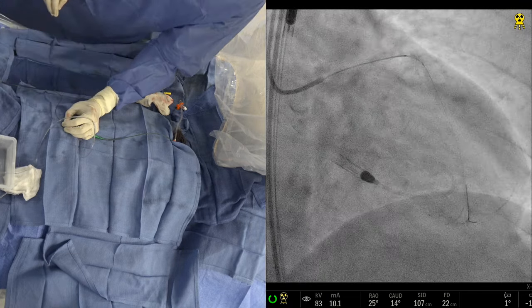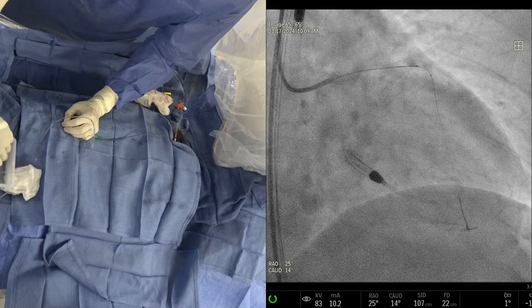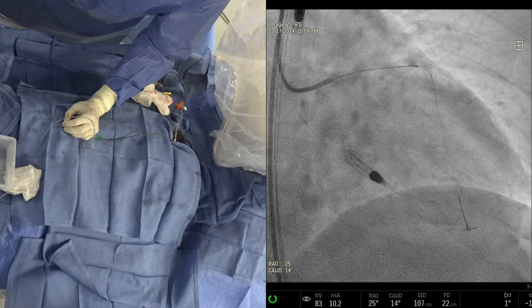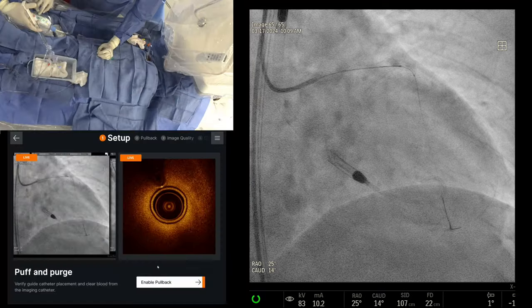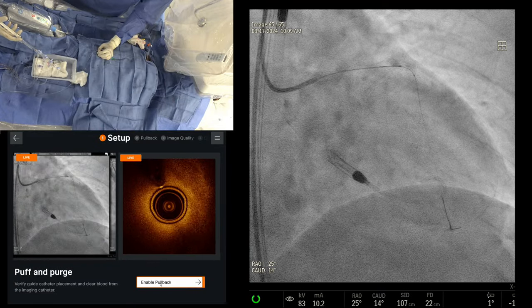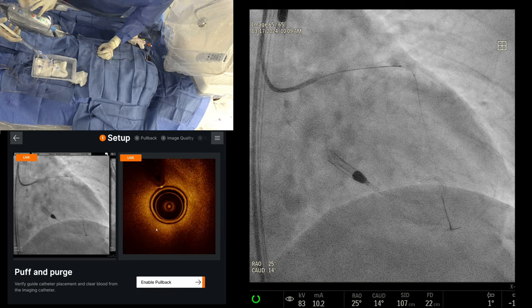Let's show the OCT on the screen. They're doing the OCT just to show the calcium we saw angiographically.